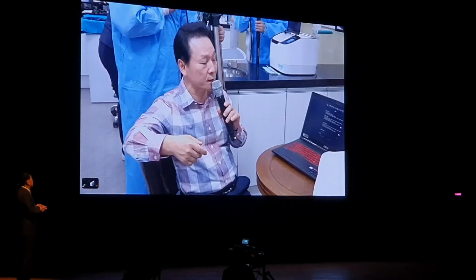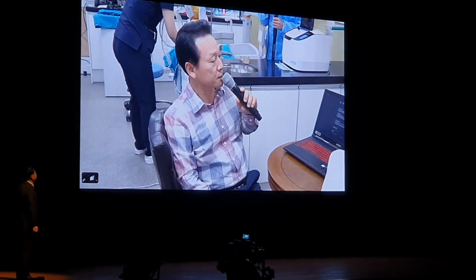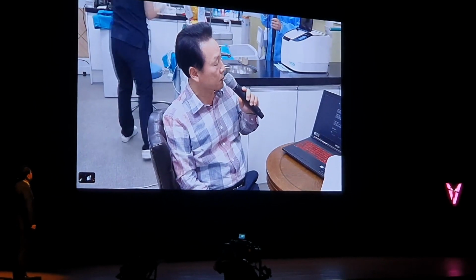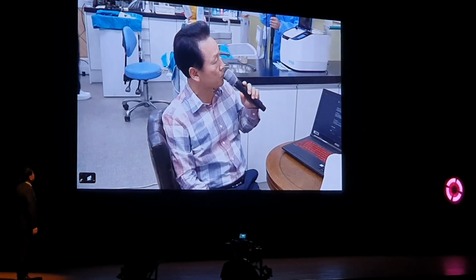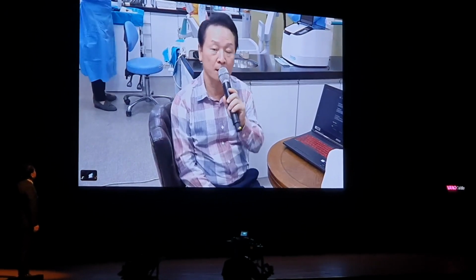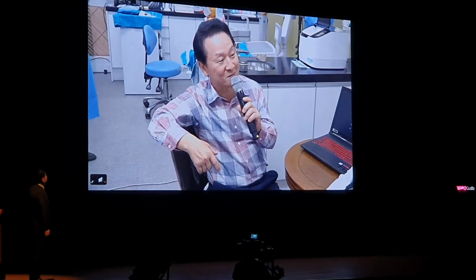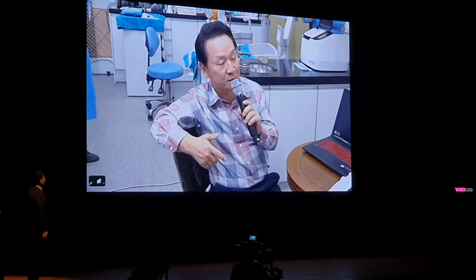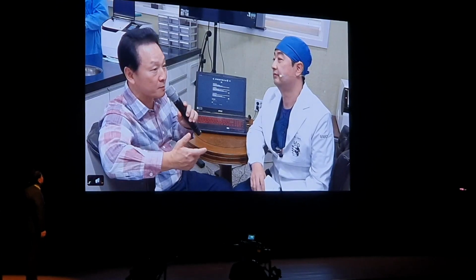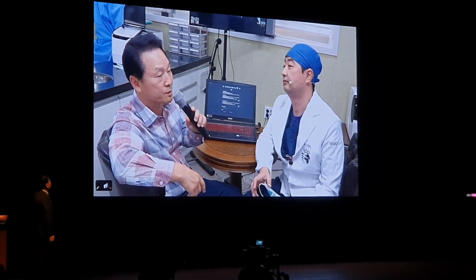Excuse me. Can I interrupt for a second? Yes, of course. It looks like a little bit too simple. This is my first time to see my CT, and I think the bone width is wide enough, and the available bone height is about 9 millimeter. Of course, I know Dr. Kim will do a great job, for sure, and the guide will be well made, but this case looks just too easy, and I think the audience won't have much fun watching it.